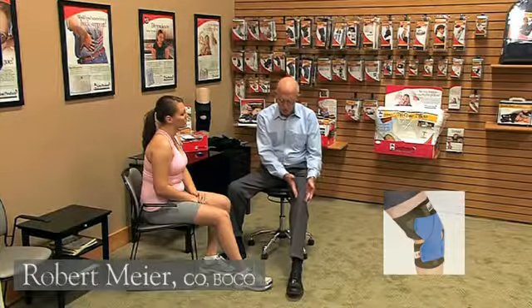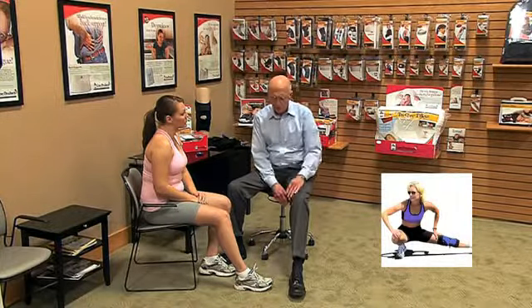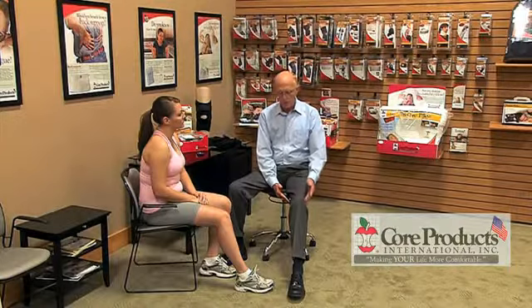Patella subluxations usually occur laterally and can be caused by a number of factors — a weak VMO, foot overpronation, or weak hip abductors can lead to patella maltracking. So bracing the patella in its groove is very appropriate so that rehab can occur without pain, or with less pain.